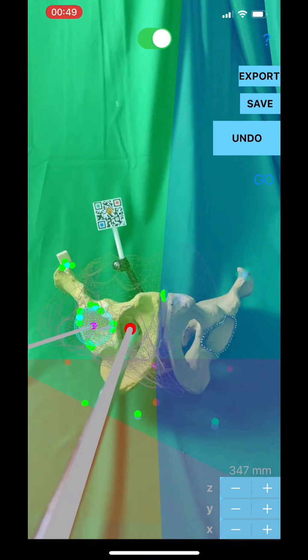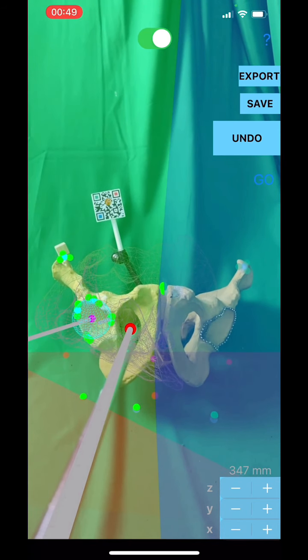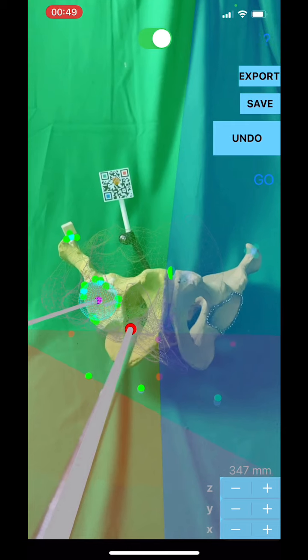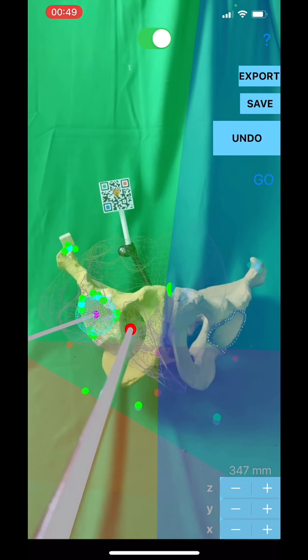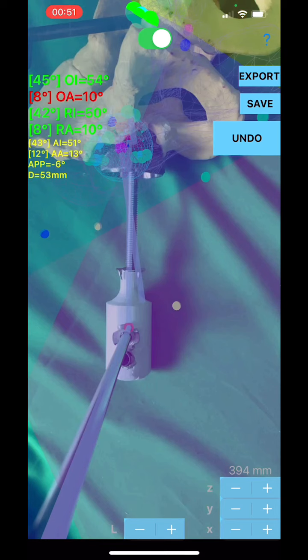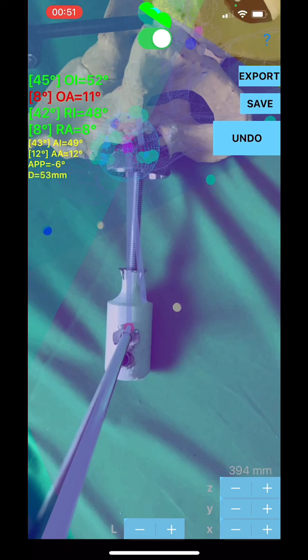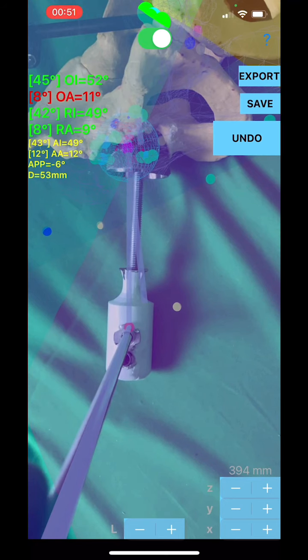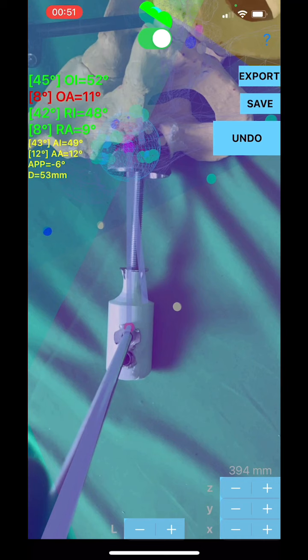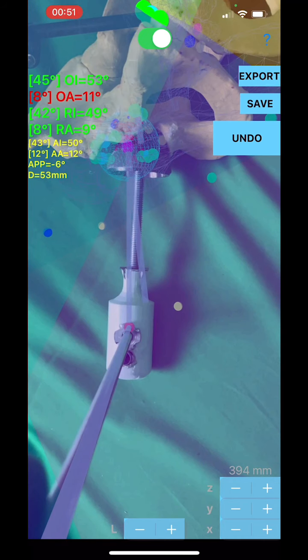A10 — deepest part of the acetabulum: three points registered as green spheres, centroid light blue sphere appears respectively. In brackets: operative inclination and anteversion static value of the patient's acetabulum hip axis; radiographic inclination static value; and anatomical inclination static value of the patient's acetabulum hip.